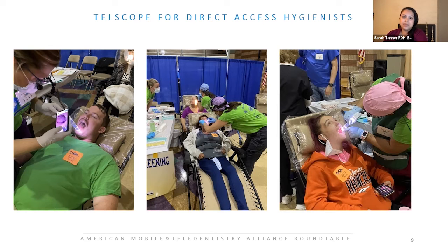So the aspirations that I have is to use this on every one of my patients in my practice, just as a standard of care, like I would a perio chart or x-rays. And also for Dr. Simpson, he may want to indulge on what a dentist is looking for within the TelScope.